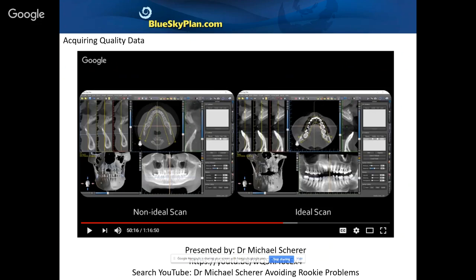To respond to a question: Blue Sky Plan can load DICOM images from every CT scanner — it's the industry standard. If you get a CT scan and it's not in DICOM format, just ask the scan center to re-export the same data as DICOM images — the patient doesn't need to be re-scanned. You can then load those DICOM images into Blue Sky Plan.